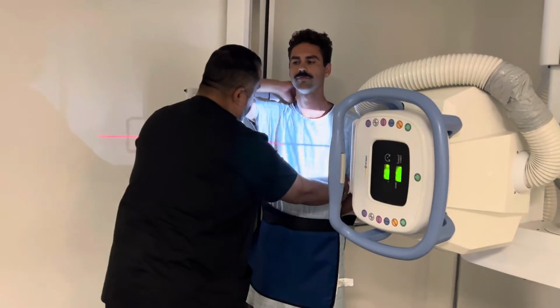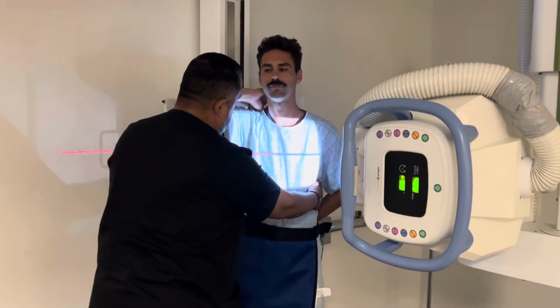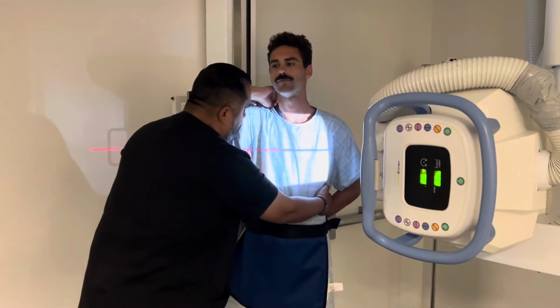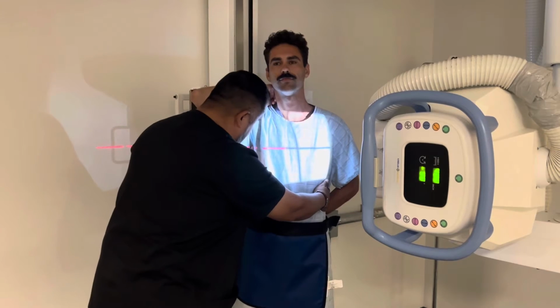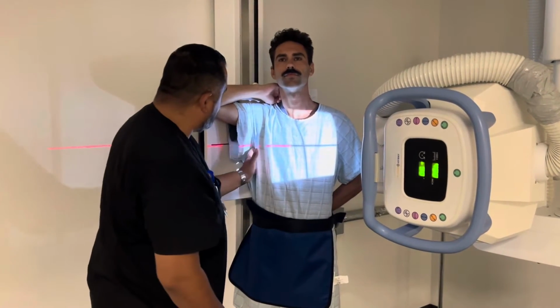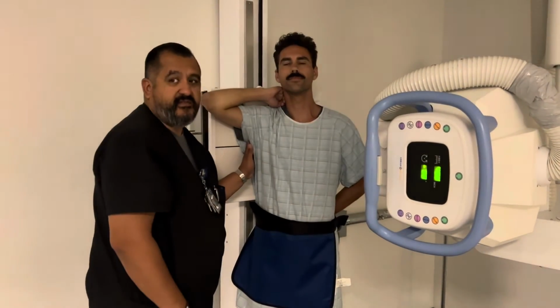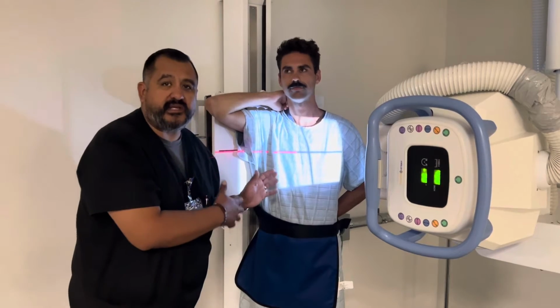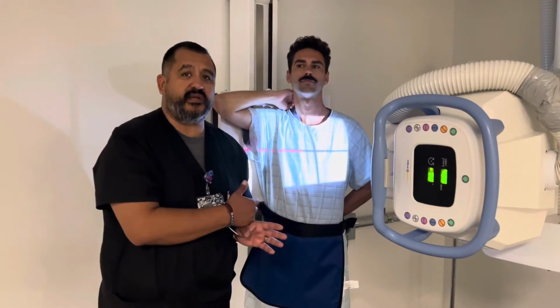And I'm going to bring him over here. Just come over. There you go, right there. And again, we're not going to get maybe all the ribs in there. He's pretty thin. We're going to come forward a little bit right there. And do you see this line? You want that line coming down the jugular notch. We're still at the level of T7, right? But we're going to go ahead and do an RPO to demonstrate the right posterior rib injury.